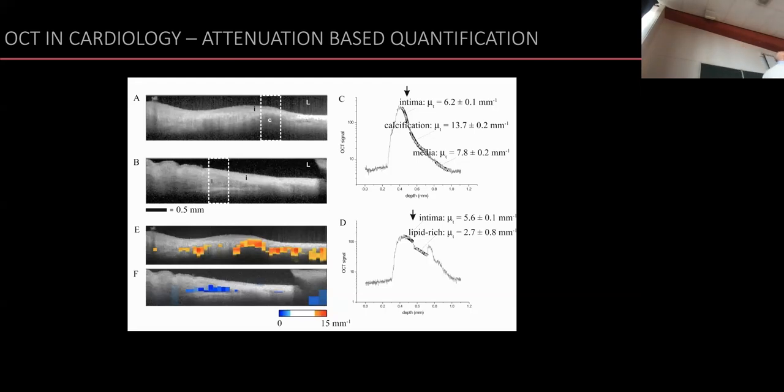Also, back in the days, we studied what we call the content of what's in this vessel wall. In case of a plaque, for example, if there's a vulnerable plaque, you actually want to know what the content is of that lipid pool, and it has clinical or treatment implications.